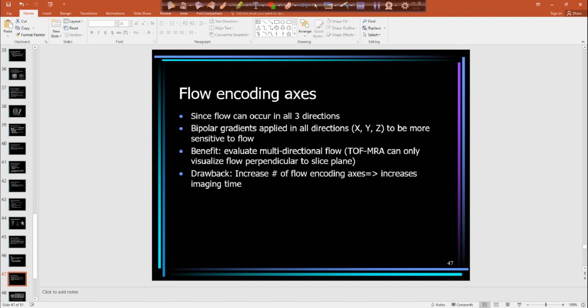So that's why it's really good for the superior sagittal sinus. You've got your transverse sinus, and it leads into your superior sagittal sinus and goes down your jugulars. You can really visualize those venous structures within the head very well with the PCMRA.